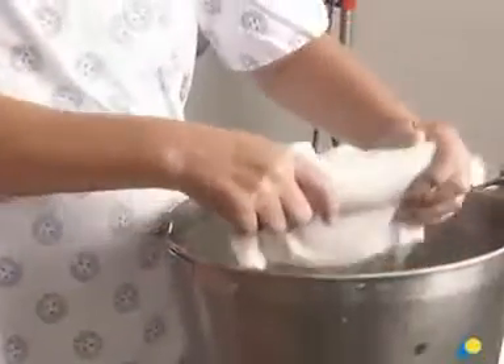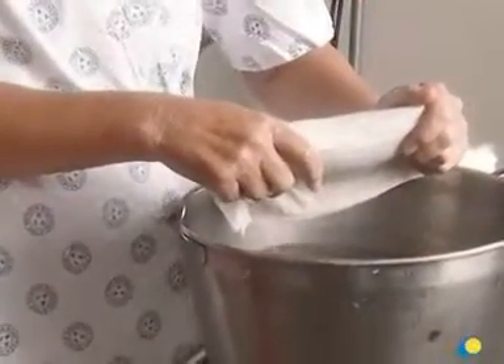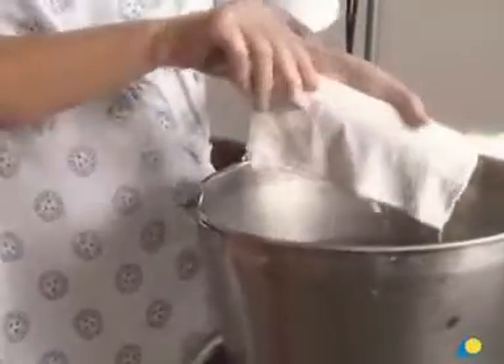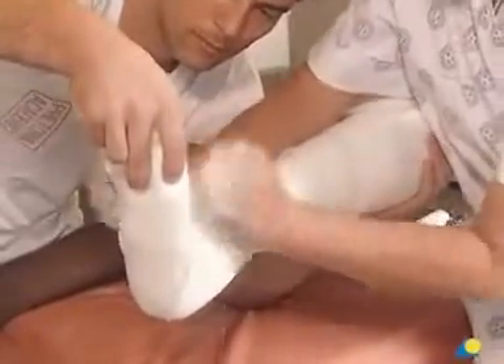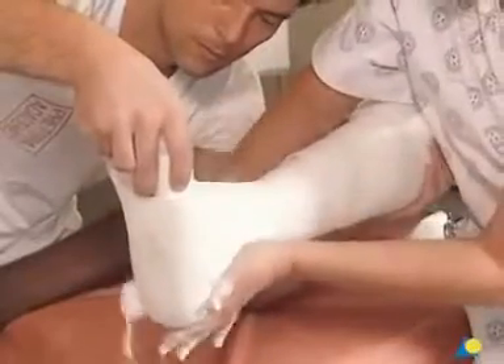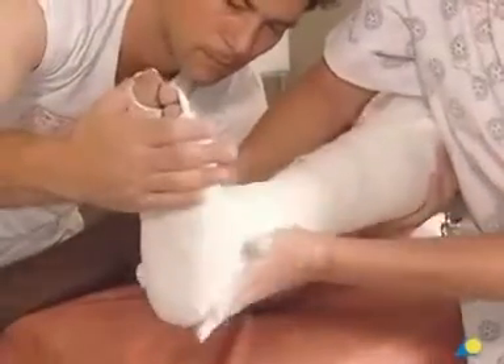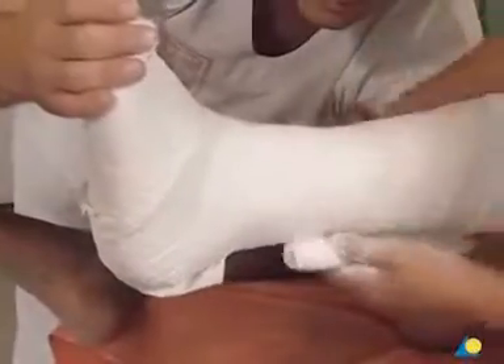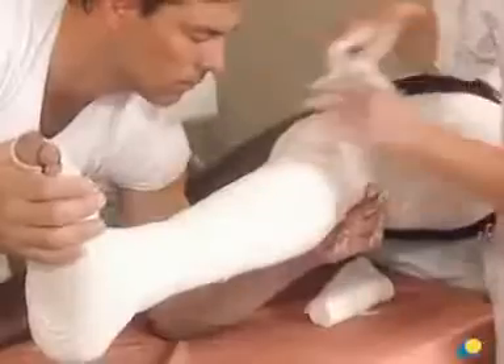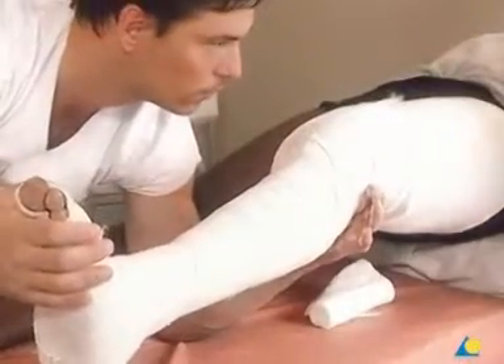The plaster bandage is dipped into the water and the excess water is removed by gently squeezing the bandage. Starting with the bottom of the foot, the plaster bandage is wrapped around the ankle in a figure of eight. The bandage is passed over the heel and then towards the knee with a 50% overlap, in the same manner as the cotton wool. In this case, a 200-millimeter wide plaster bandage is used. A 150-millimeter bandage may also be used, however it will take longer to apply.